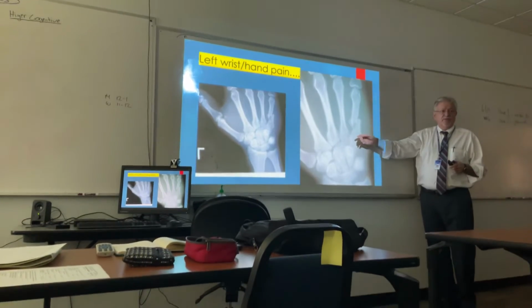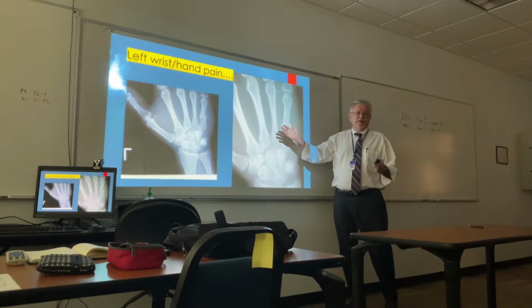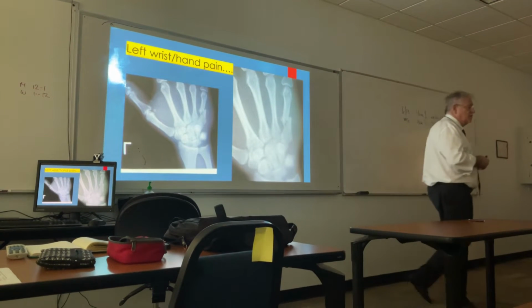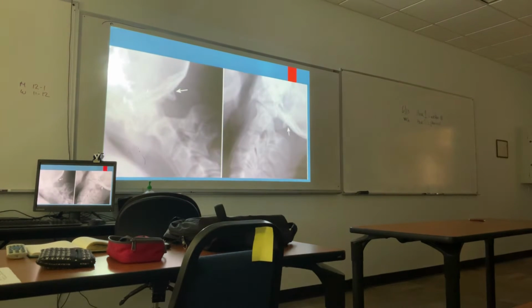x-ray. Now, when we get to semester 8, we're gonna circle around and find out all the different types of fractures that occur, but we're gonna say the same thing. Then I'll ask you where the center goes for the hand, okay? And the reason, they're not all this obvious, okay? If they're subtle, that's the reason for doing the 3 views, okay? All right.